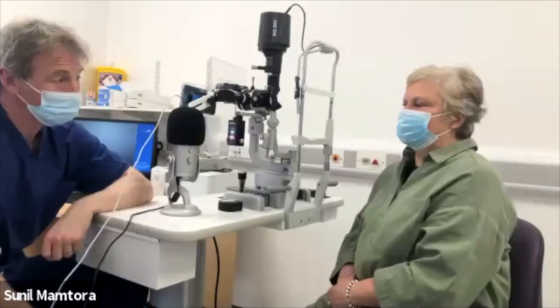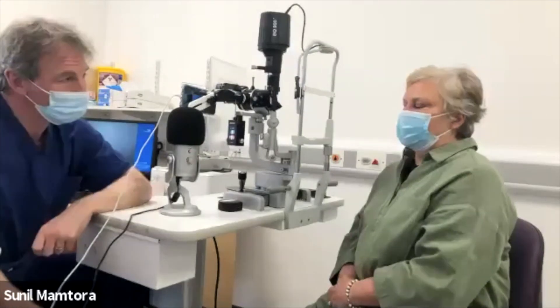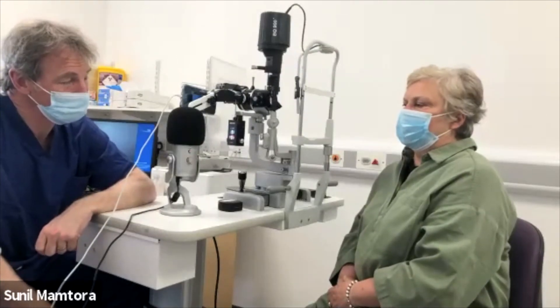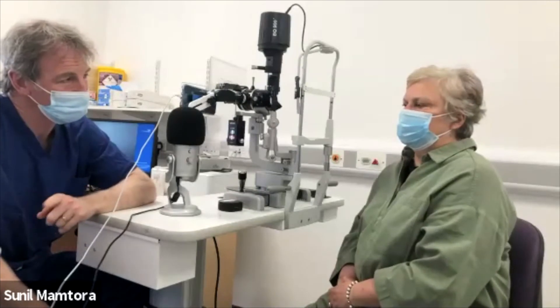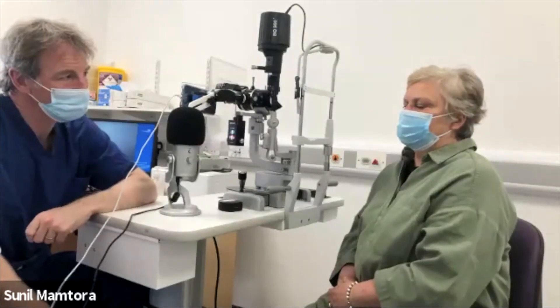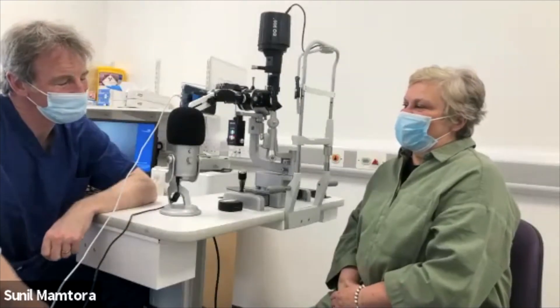A nice healthy disc with dilated pupils — very healthy. A lot of the problems obviously stem from back in 2014 when you presented to us with a retinal detachment in your right eye. Tell us a bit about that — what did you notice at the time? Funnily enough, it was the day of my daughter's wedding.